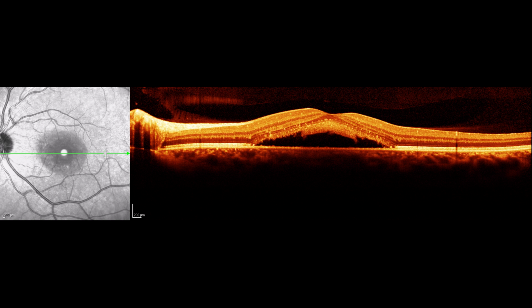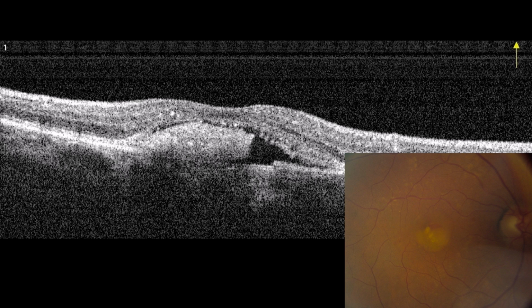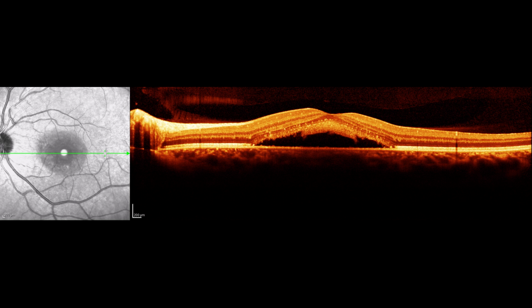All right, fluid under the retina. So not a diagnostic dilemma here. This patient had central serous. This is a patient with Best disease. This is a vertical slice. Yeah. I don't think it's fibrin.